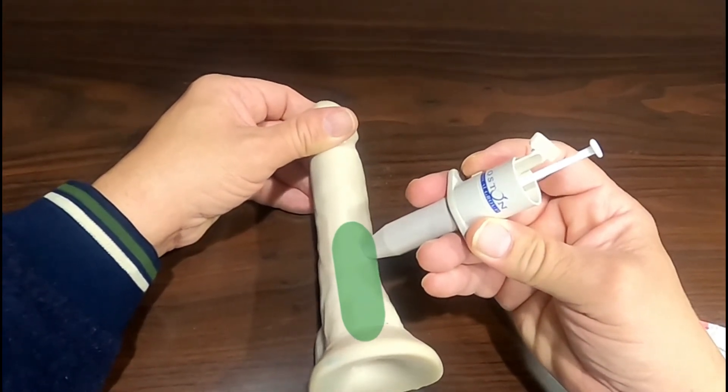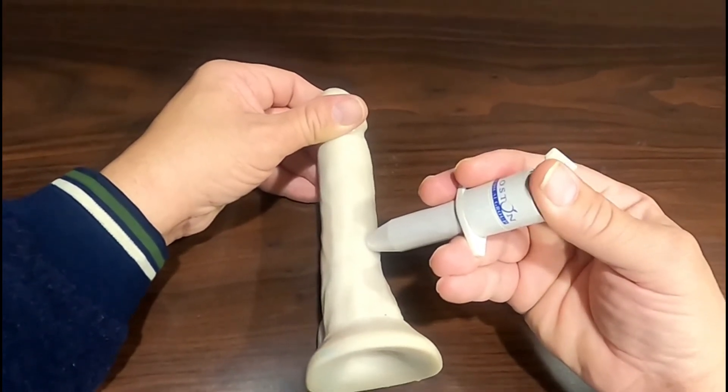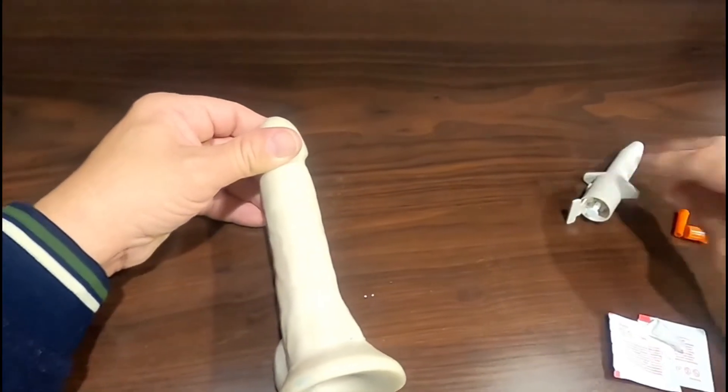With your index finger, press the button on the applicator then push the plunger all the way down until it stops. Then withdraw the applicator in one smooth motion.